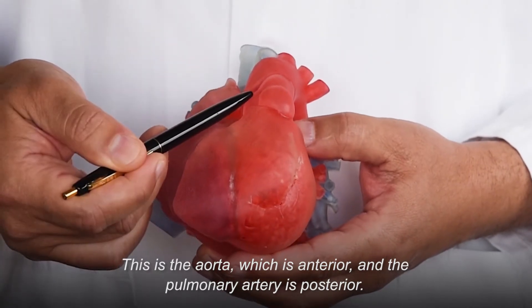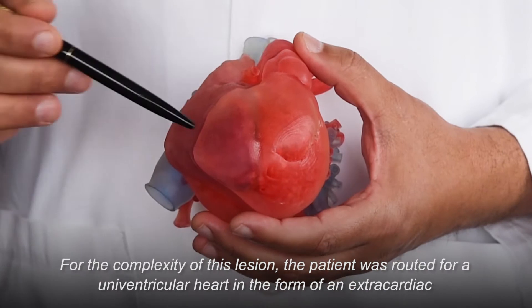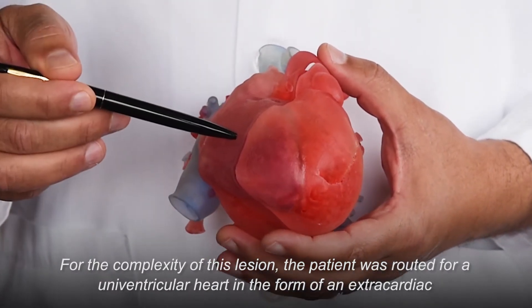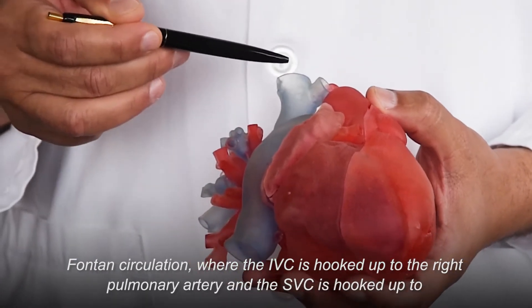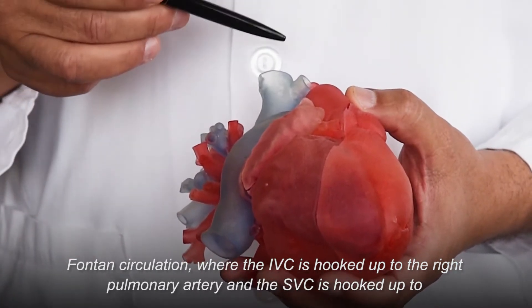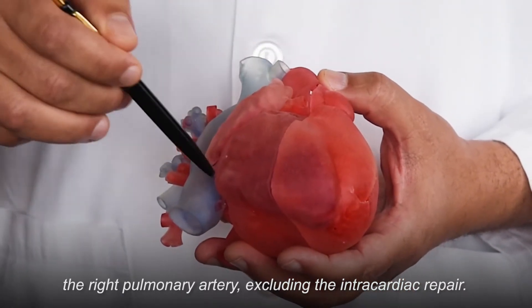This is the aorta, which is anterior, and the pulmonary artery is posterior. For the complexity of this lesion, the patient was routed for a univentricular heart in the form of an extracardiac Fontan circulation, where the IVC is hooked up to the right pulmonary artery and the SVC is hooked up to the right pulmonary artery, excluding the intracardiac repair.